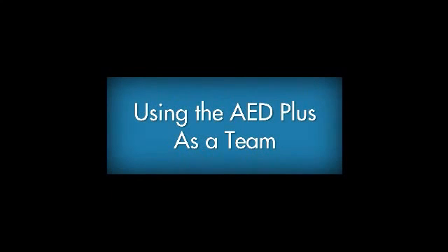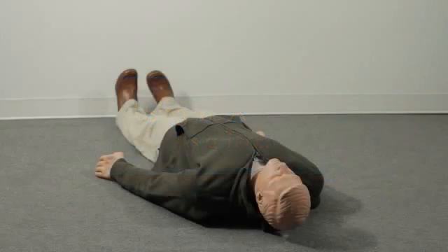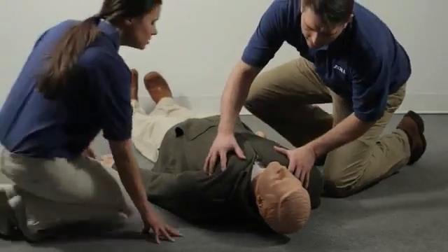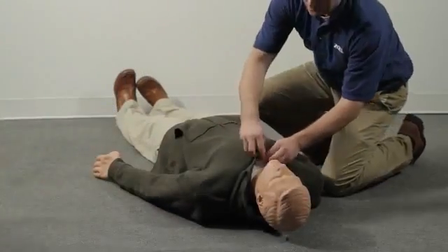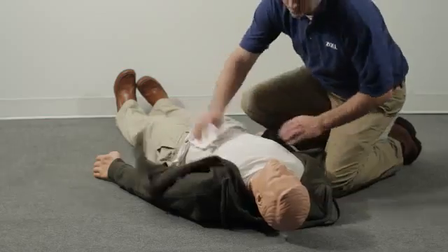Using the AED Plus as a team. Let's look at a situation where an AED is used in a team rescue with more than a single rescuer using the AED Plus. At work, you see a person fall to the floor. You check to make certain the person is truly unresponsive. Immediately send a coworker to call 911 or the local emergency number and get the AED.